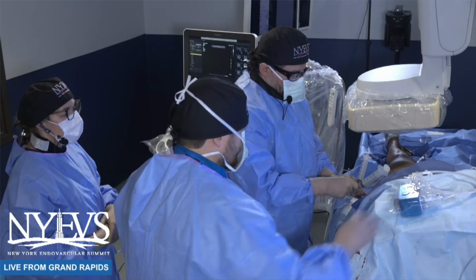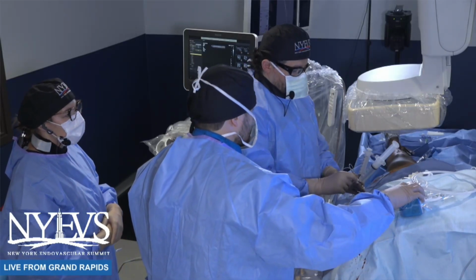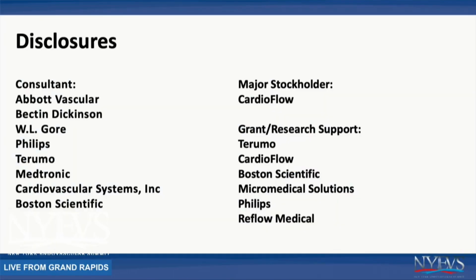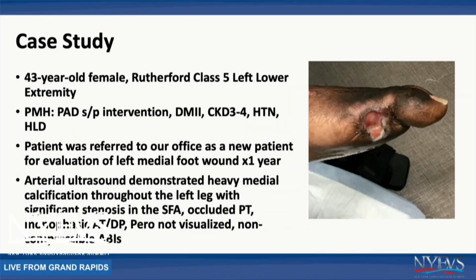All right, well, welcome guys again to the second installment. This is not acute limb ischemia, this is another CLI patient, but I want to go ahead and present this case to you. Can you guys pull up the slides, please? Take this final image here.